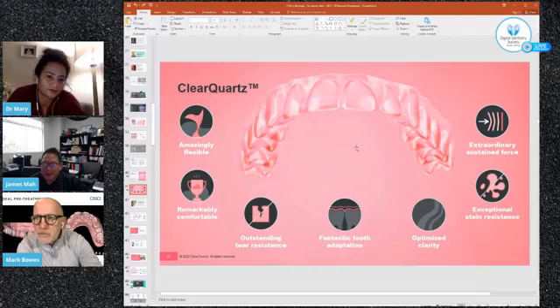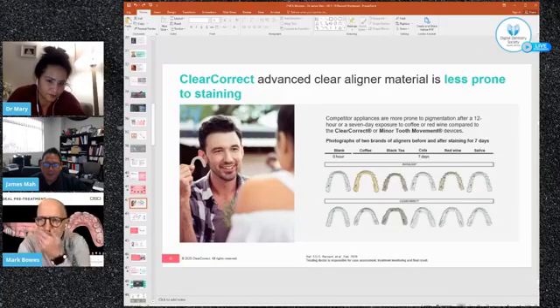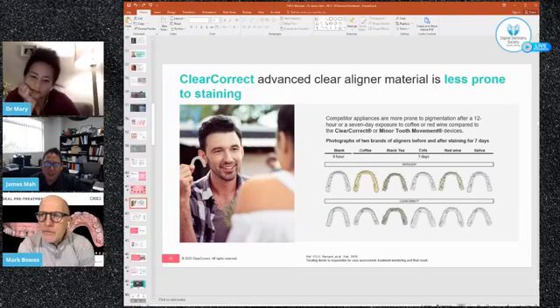And I think the sustained force is also going to result in more comfort, particularly early on. Over time it'll dissipate, but over time it'll be more comfortable. At first, with the historic material, it was more of a snap fit. You could hear it when you put it in a patient. With this material, it doesn't have the same fit because the force is more gentle over time.